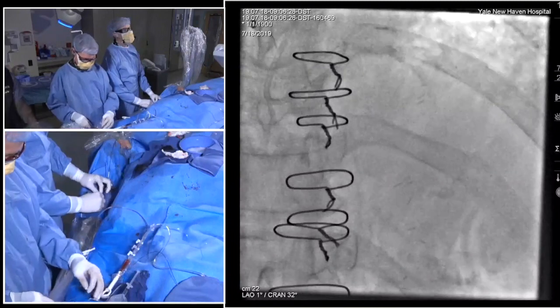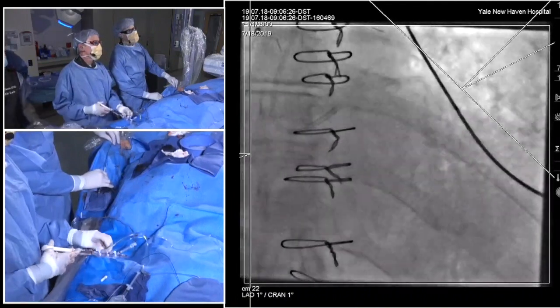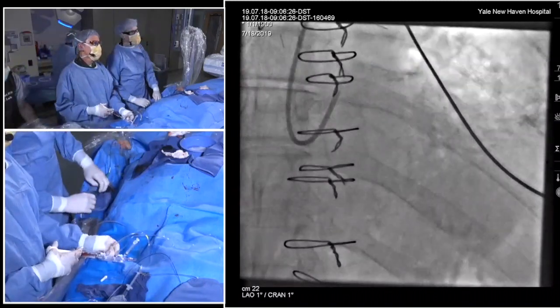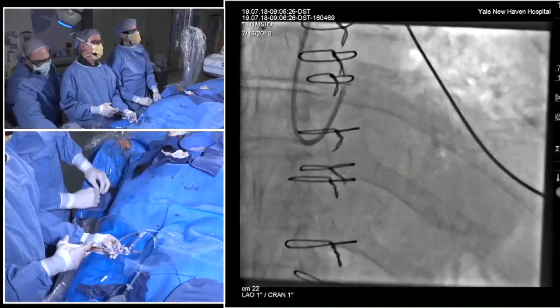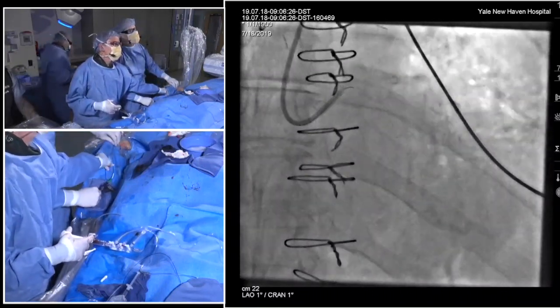Anybody that thinks about putting a 3.5 or smaller stent in the left main should stop and image, because most human beings do not have 3.5 or less left mains. Mm-hmm. Yeah, we saw that actually in our lab. There were pretty high volume operators, but we went from very spotty imaging use to pretty much over 90% use of imaging pre-stenting, and our stent size over those couple of years increased by, on average, just under 1 millimeter.